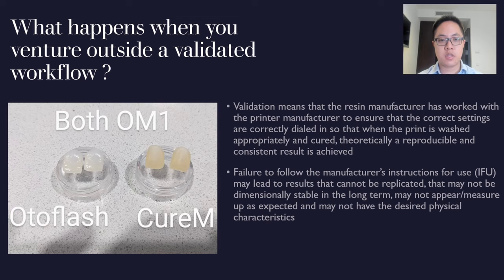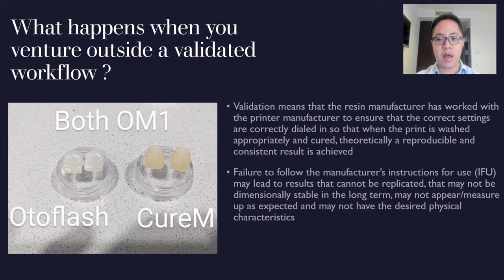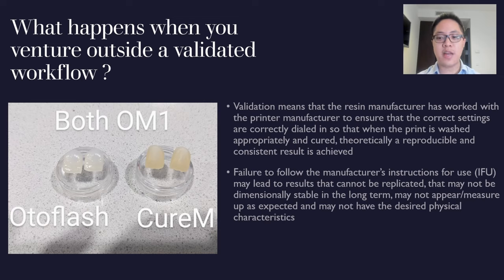What went wrong? Even using the Cure M — the right curing unit — I got the wrong color. It turned out that the instructions specifically mention TC80DP prints should be placed in the provided metal bowl. When you get the Cure M, you get a metal bowl with it. I didn't put the crowns in the metal bowl before curing, and as a result I got this unintended yellow-brown shade. When I repeated the process with the metal bowl, the shade was correct. Small things like that — you've got to pay really close attention to the instructions for use.